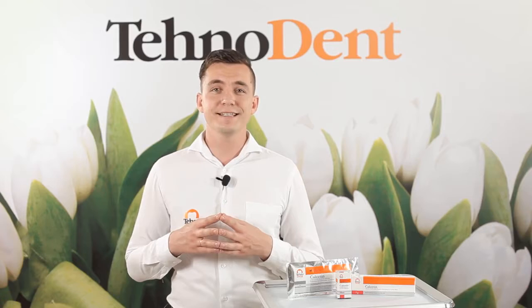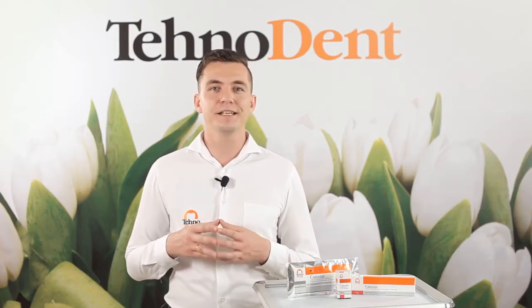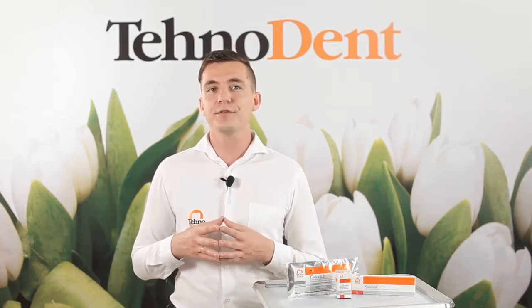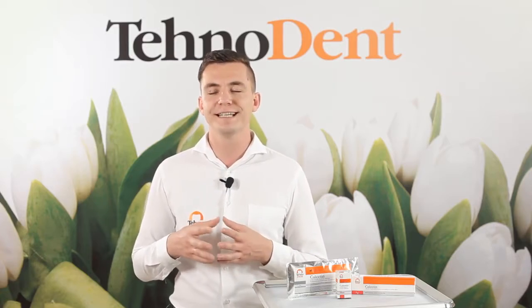In a case of conservative treatment of chronic periodontitis, as well as any perforation of the root canal, after applying the paste Calcetin for endodontic treatment, after 3–6 weeks it is possible to carry out a permanent filling of the root canal with the sealer.